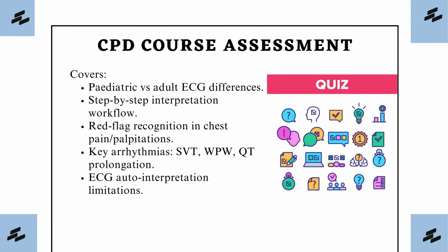CPD Course Assessment. At the end of this course, you'll complete a short assessment. It will test your knowledge of pediatric versus adult ECG differences, structured interpretation steps, recognition of red flags, identification of arrhythmias, and the pitfalls of auto-interpretation. This ensures you can apply the course learning in practice.